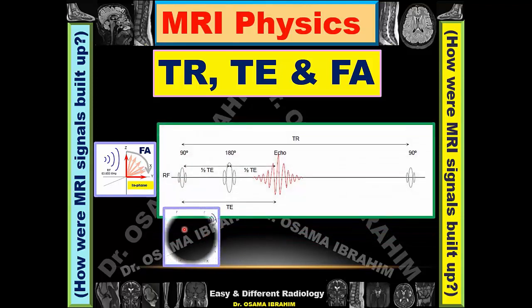After removal of the radio frequency pulse, two things occur: realignment of the protons to the Z axis and also dephasing of the spinning protons. This dephasing, we follow it by another 180 degree pulse before reaching the starting point to re-excite it again, and now the protons are in phase again, called the rephased status. And then switched off again. After switching it off, the protons dephase again.